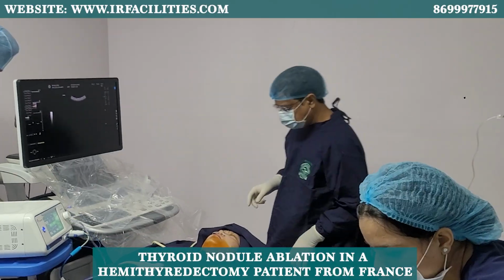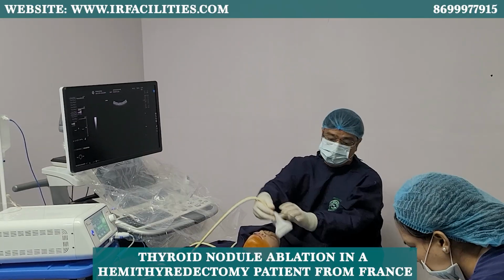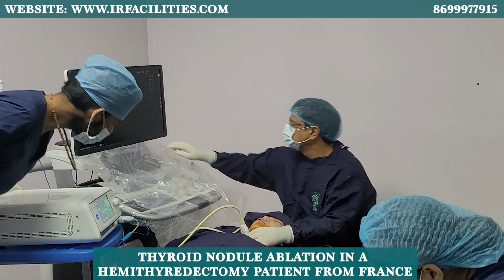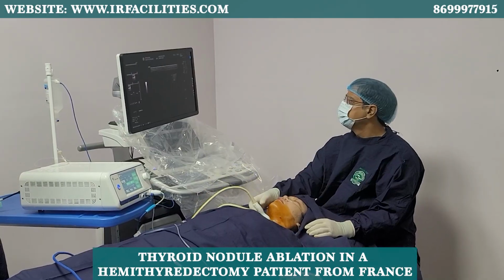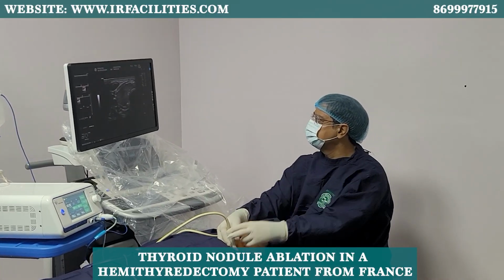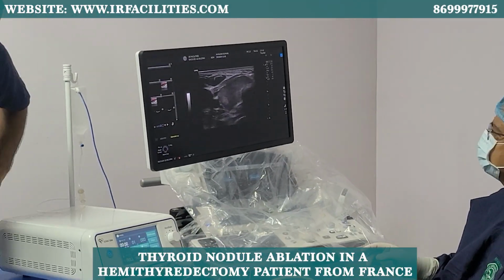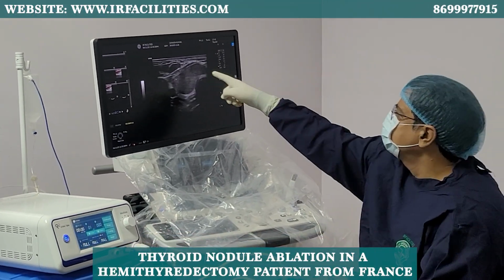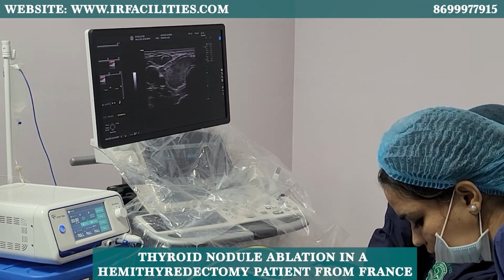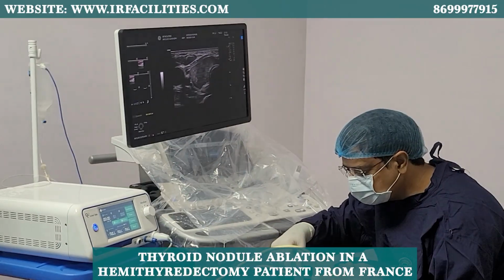There are certain lesions. So I know it's very difficult to understand why. The right thyroid has been removed, and this is the left one. Left one has these nodules, you see. These are the nodules. The bright one, and this is the other one. So what we're going to do is ablate, and then there is something there also. What I'm going to do is give her a little anesthesia.